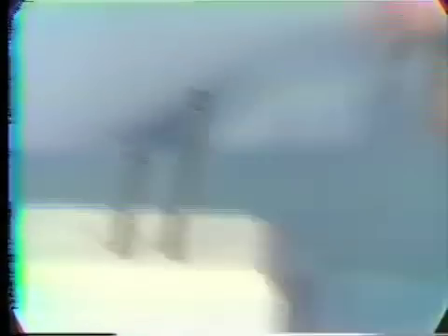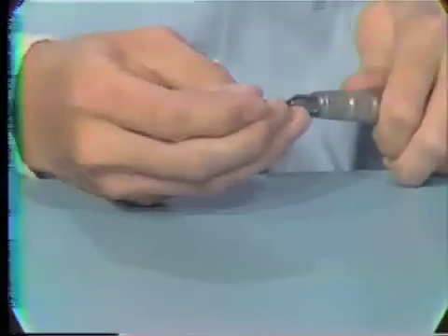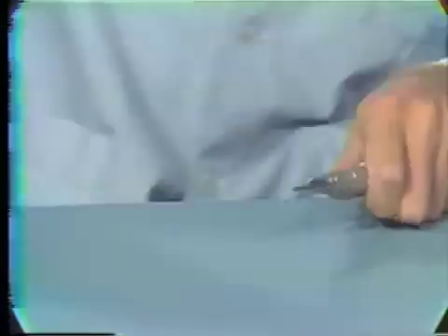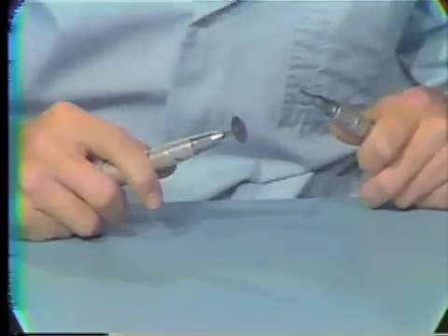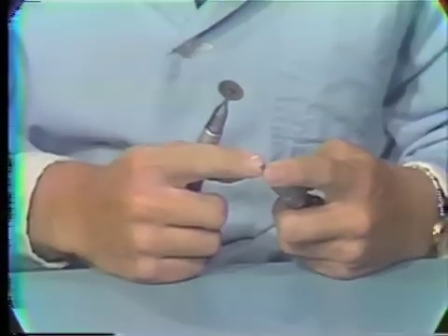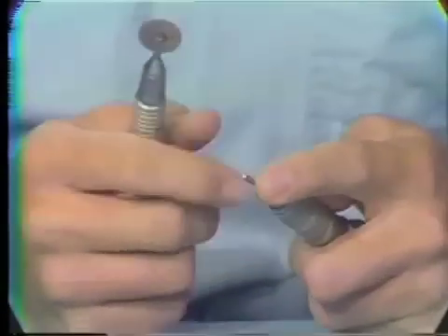The first step is to cut down the length of the burr. In this case, I'm going to cut off approximately four to five millimeters. I'm going to show cutting it off with the straight handpiece of the other electro-torque. However, if you only have one electro-torque, you could just hold the burr in the pliers and cut it.